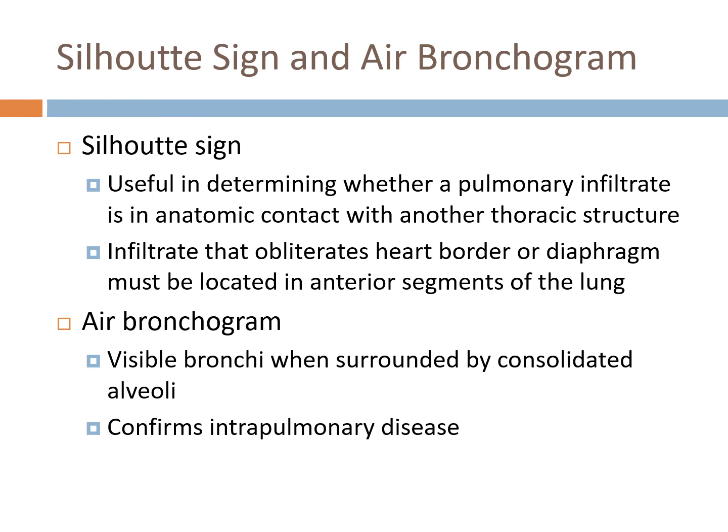So diseases that consolidate the lung tissue and also fill the airways won't produce air bronchograms. But if you have the situation where the air in the bronchi stands out against the surrounding consolidated tissue, then you'll have these air bronchograms.